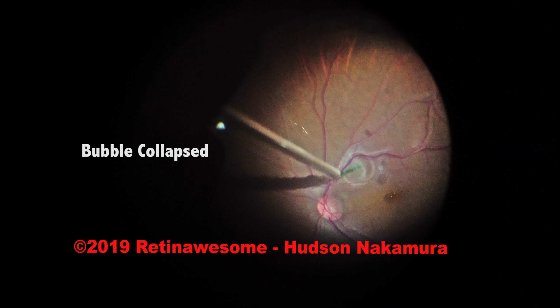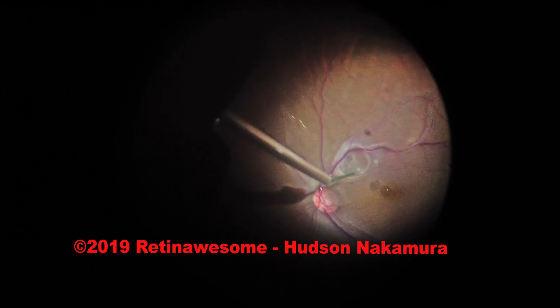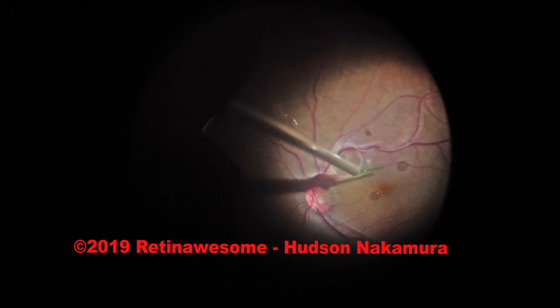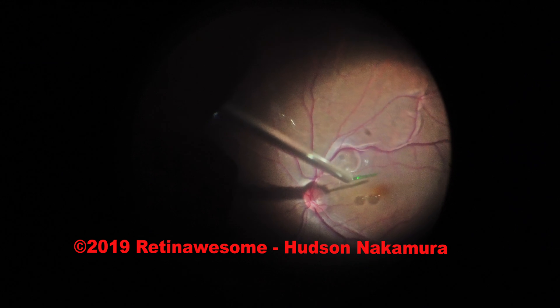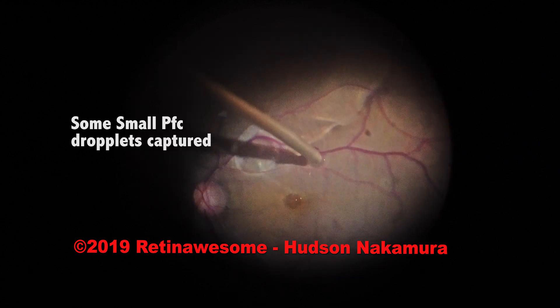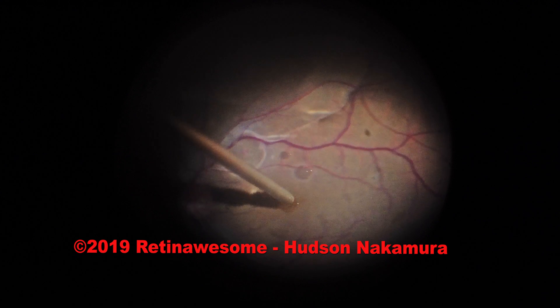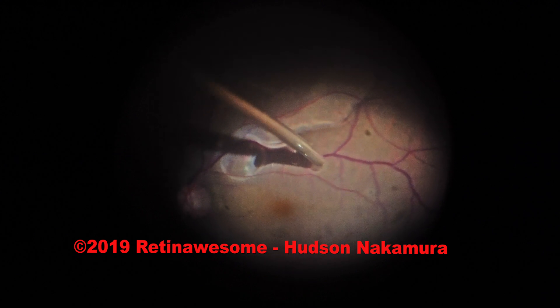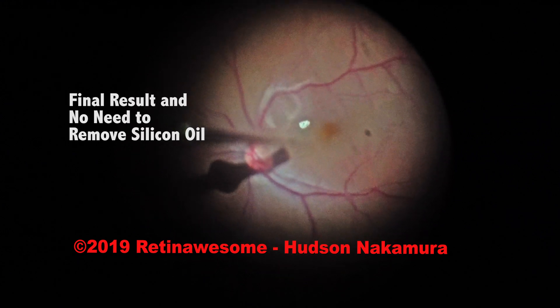We approach the bubble with the bent tip of the cannula and aspirate the internal PFC very gently. We go after some missing PFC droplets elsewhere. That's about it. We remove the BSS infusion as soon as we completed this step.